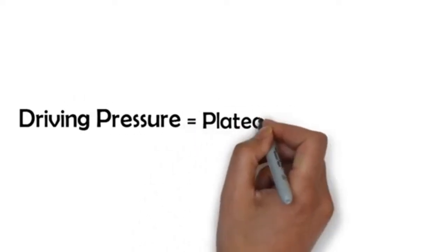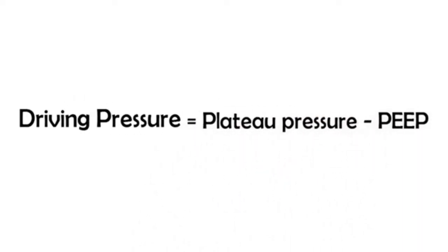So what is driving pressure and how do you use it for your patients? We can start by taking a look at the definition of driving pressure. It's defined as the difference between the plateau pressure and the total PEEP. The PEEP, of course, is the end expiratory pressure, which should include both the intrinsic PEEP and the extrinsic PEEP.